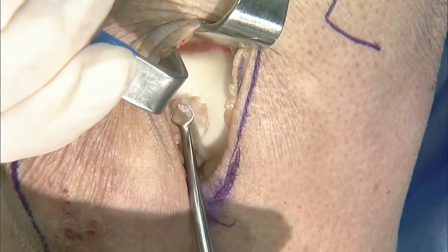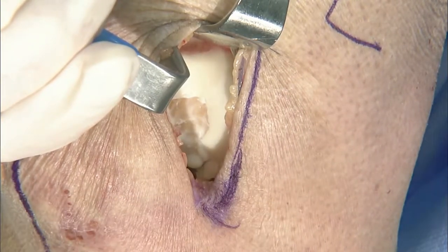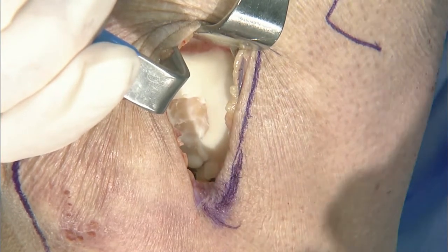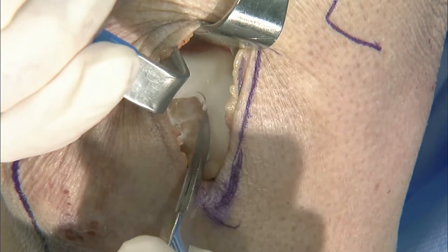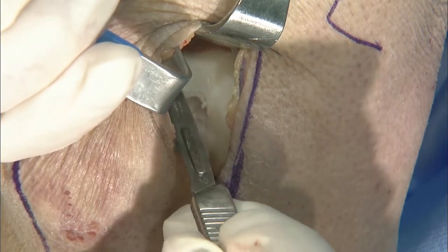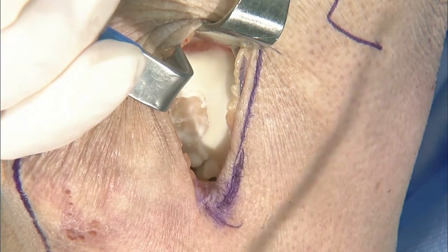So if this is your supposed defect, do you ever use a knife then when you want to start to create your outline? I do. I think that's a good point. We don't have the right knife here. I only have a big blade right now. But one way to do that is really, like Adam said, to define out along the good cartilage where you're going. And so if we're getting into really technique of defect preparation, I'm going to basically make that line that he showed you right up here so that you can see what you would do. These ring curettes are really nice for that.